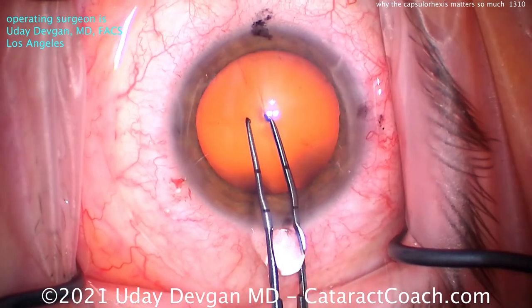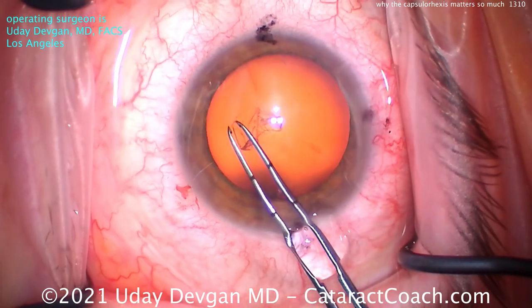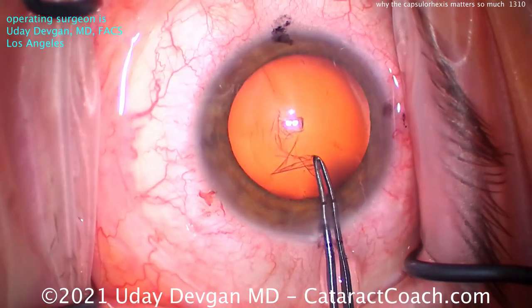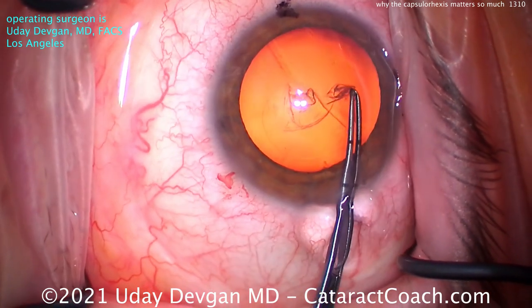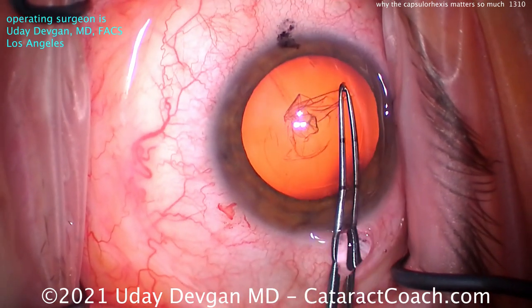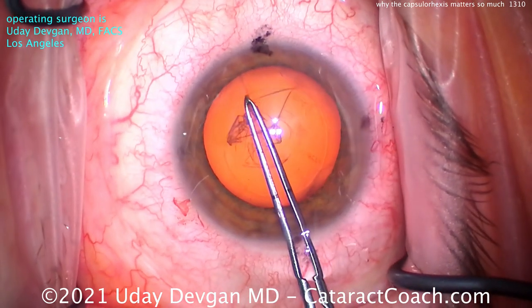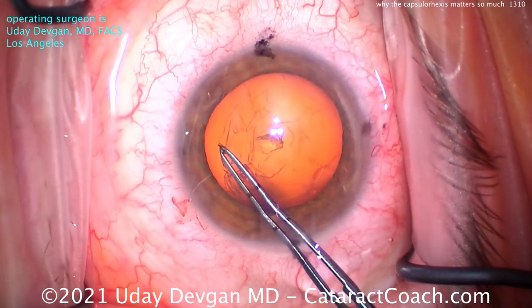We're measuring out our rhexis and we're going to create that. Now the advantage of a capsulorhexis, even better than a femtosecond laser-created capsulotomy, is that the edges are really strong. By tearing the tissue here, there are no weak edges. It's continuous, it's curvilinear, and there are no weak spots.